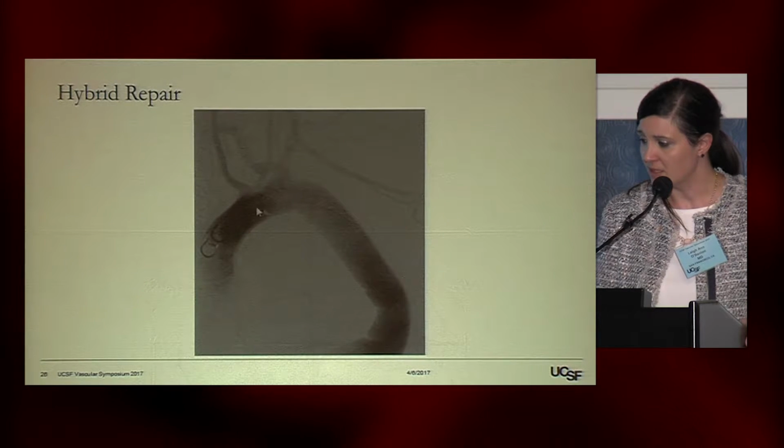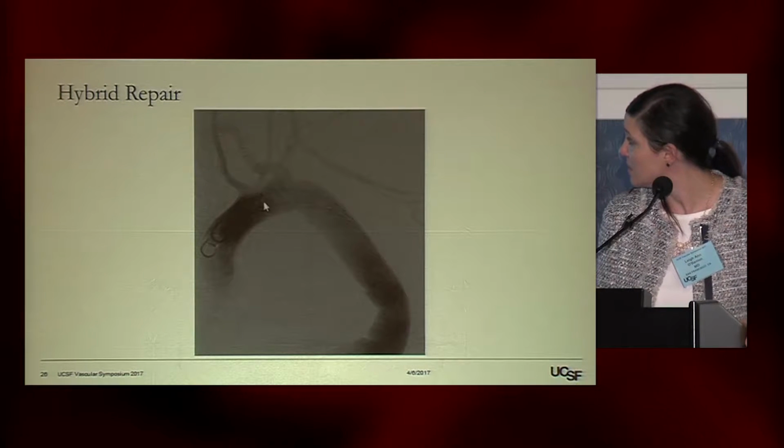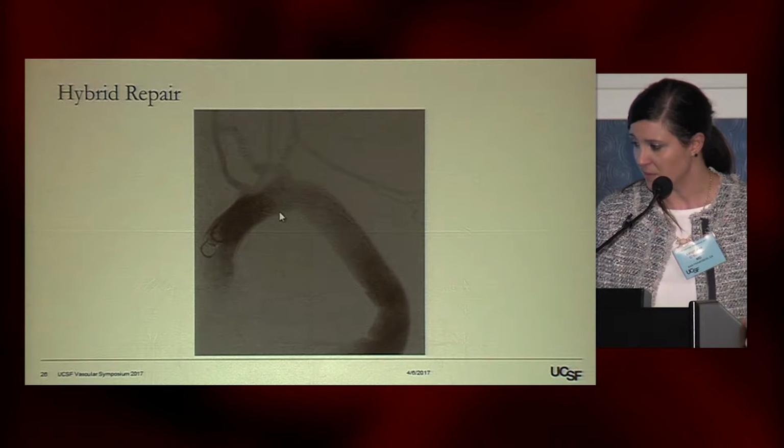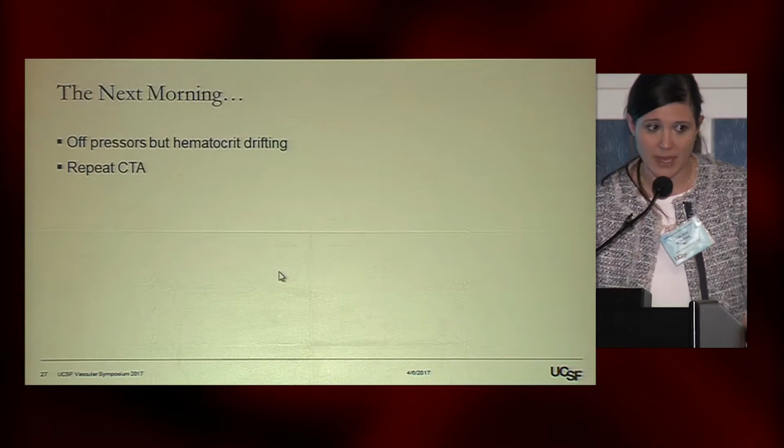This is our completion angiogram. The stent graft is sealed right here with no evidence of an endoleak. We've got good perfusion of his left subclavian, and there are Amplatzer plugs in place. And he went back up to the ICU.